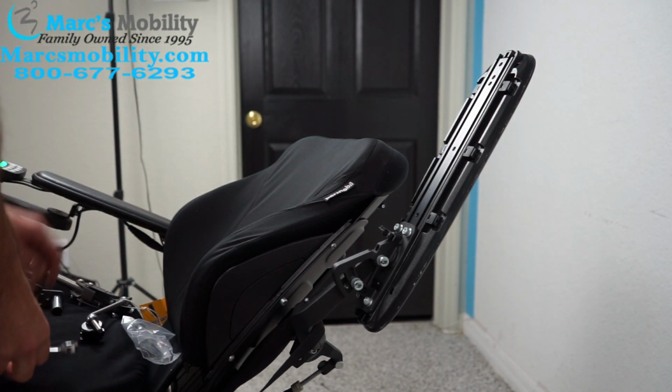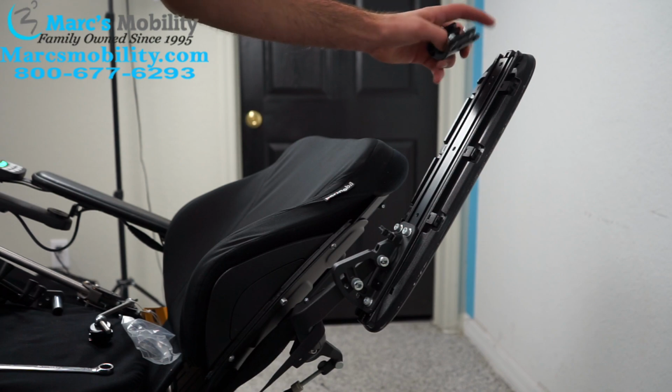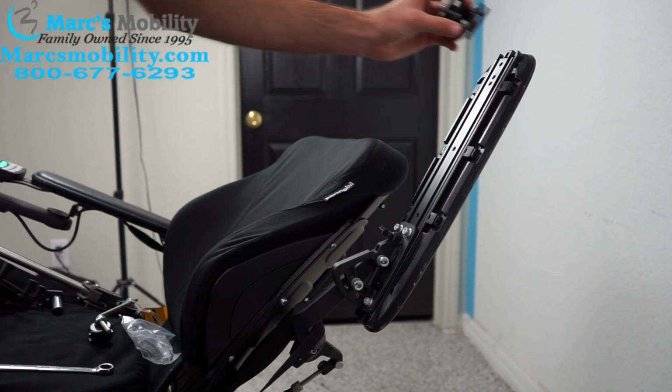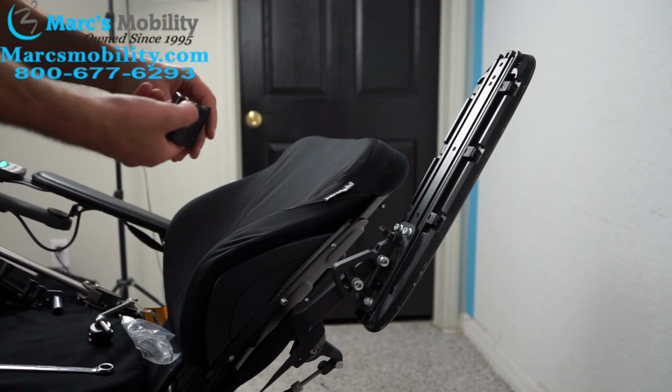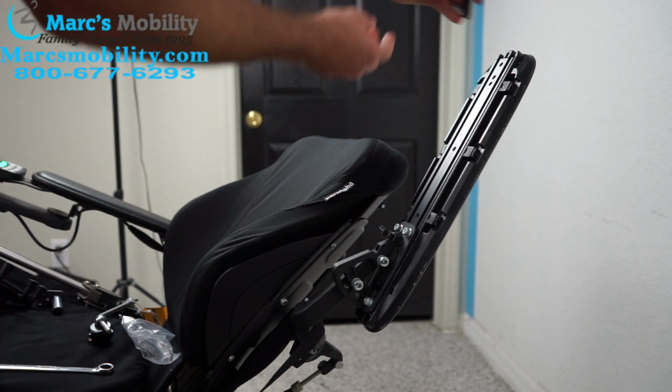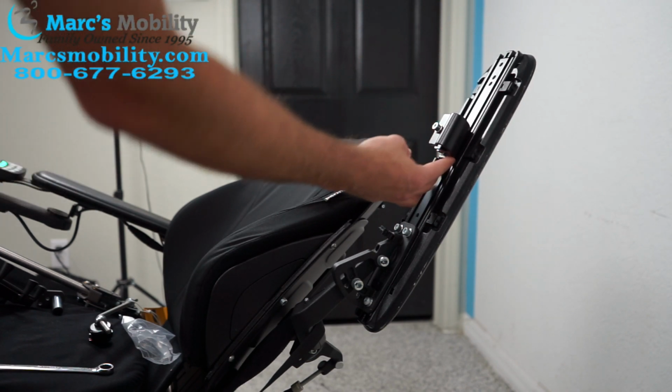So I'm going to start with our mounting bracket. It looks like this, and it's going to go into the Permobil arm through these 2 sliding rails. You can have it on the outside, you can have it on the inside, whichever way you want it to go. I'm going to try to get it in the center of the arm. Then it should just slide in through the rails.